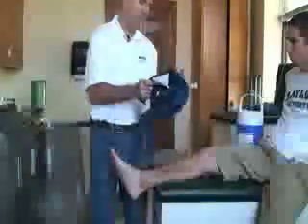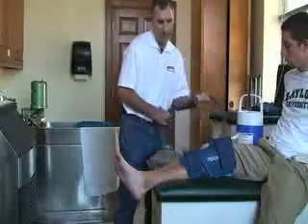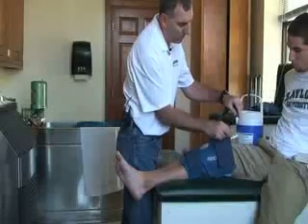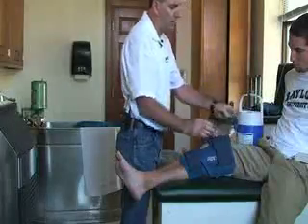Next we attach the knee attachment. We adjust the velcro to make sure it fits around his knee comfortably. Then we attach this end of the cord to the top of the attachment — it should snap in. Make sure you listen for the click so that you have a secure attachment.